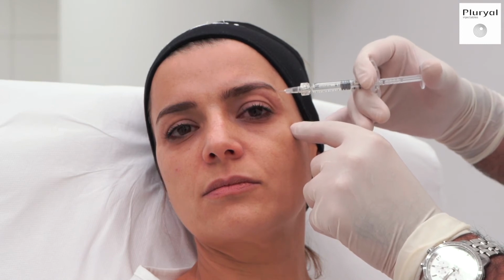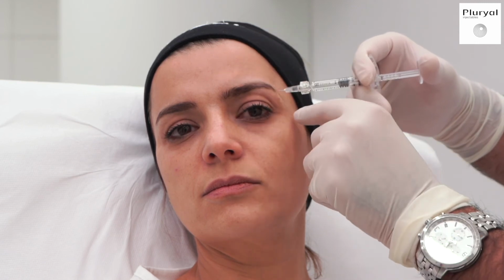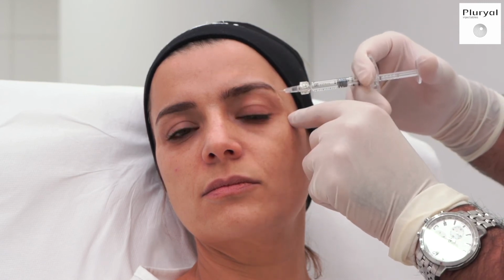Whenever we do an injection, we don't look at the syringe. We always look at the patient to see if there's a blanching effect.